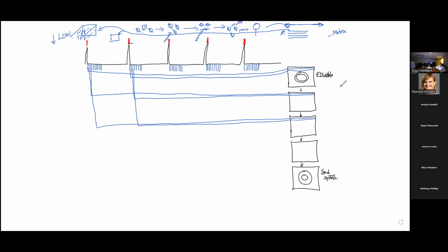So when these images are acquired, we've got to take care of motion. So one is the cardiac motion, right? So we trigger to the QRS complex. We recognize over a series of beats, we're making our movie, right? We've got to go all the way down and capture. You know, by the time we get over into here, here's our T wave.